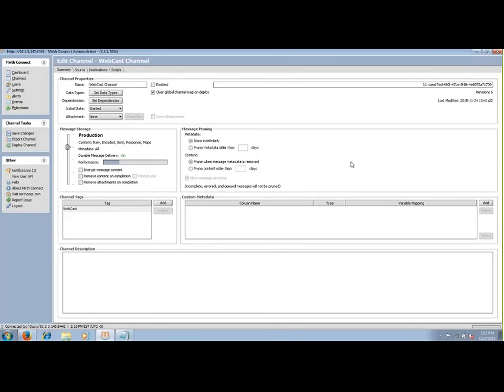Message pruning refers to storing message metadata and content, and can be understood as purge settings for message logs. Metadata refers to anything logged within the channels, such as variables. Content refers to the message itself.